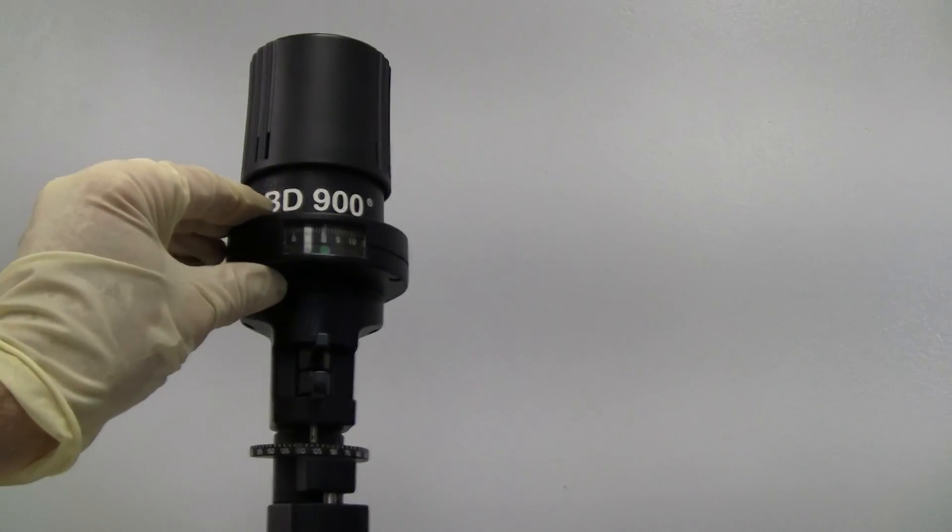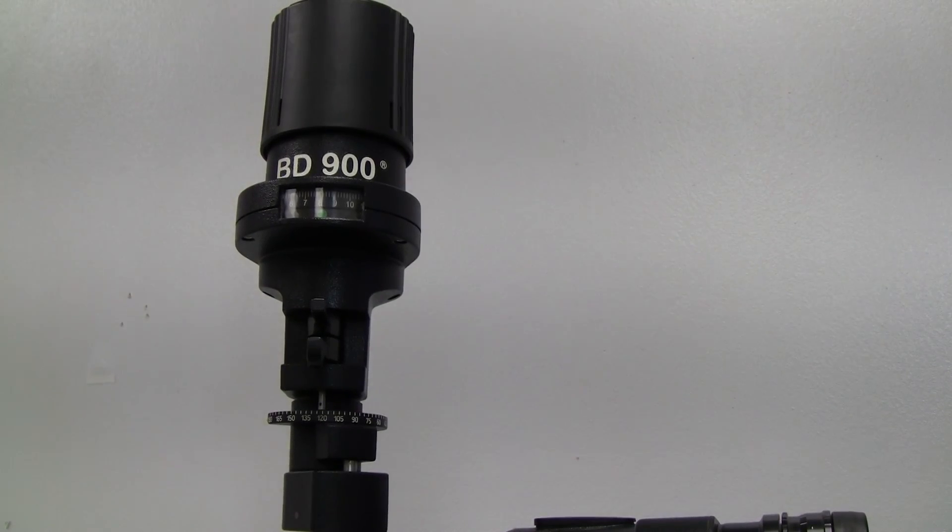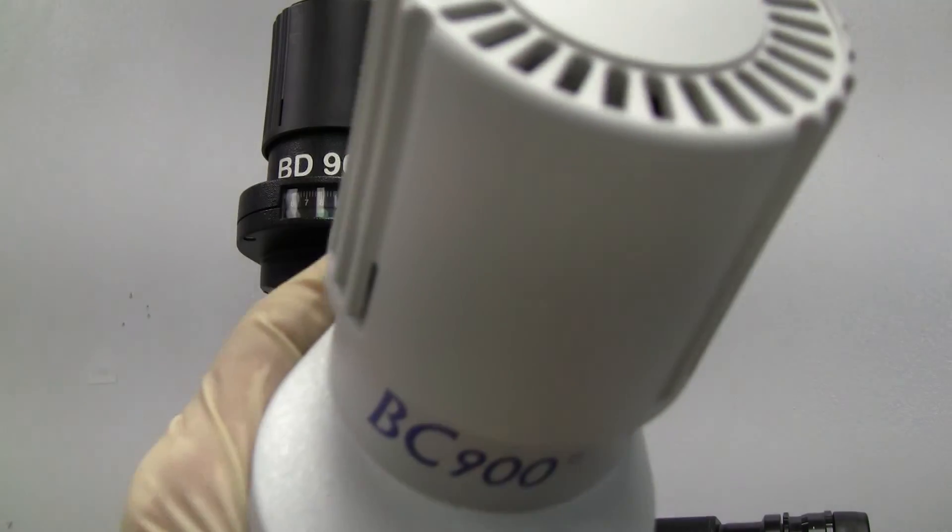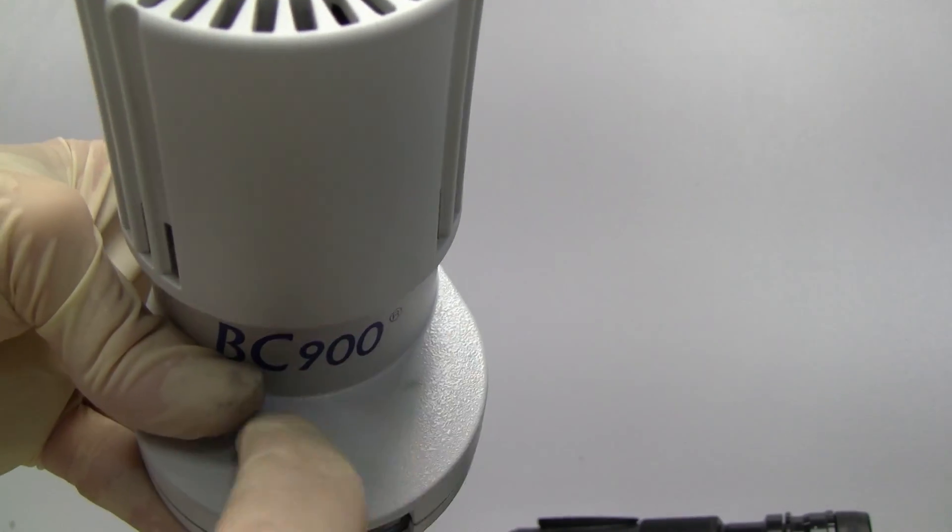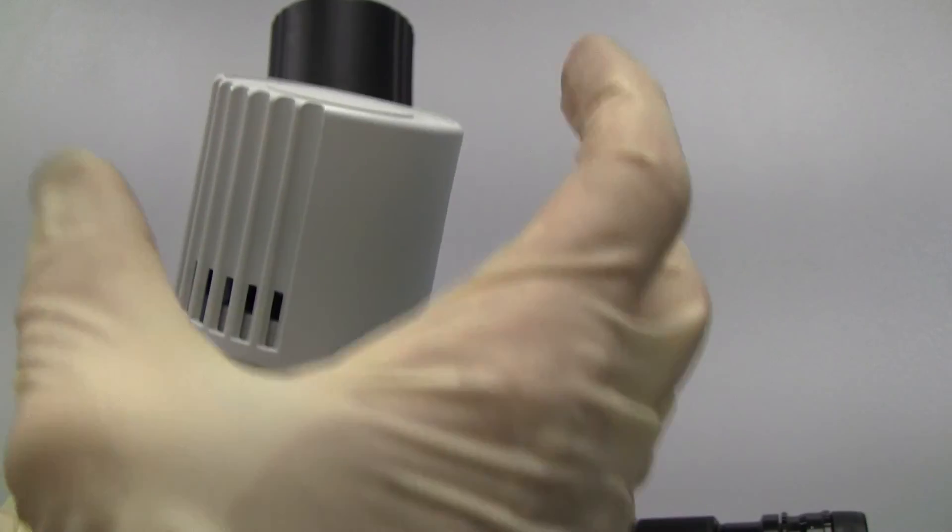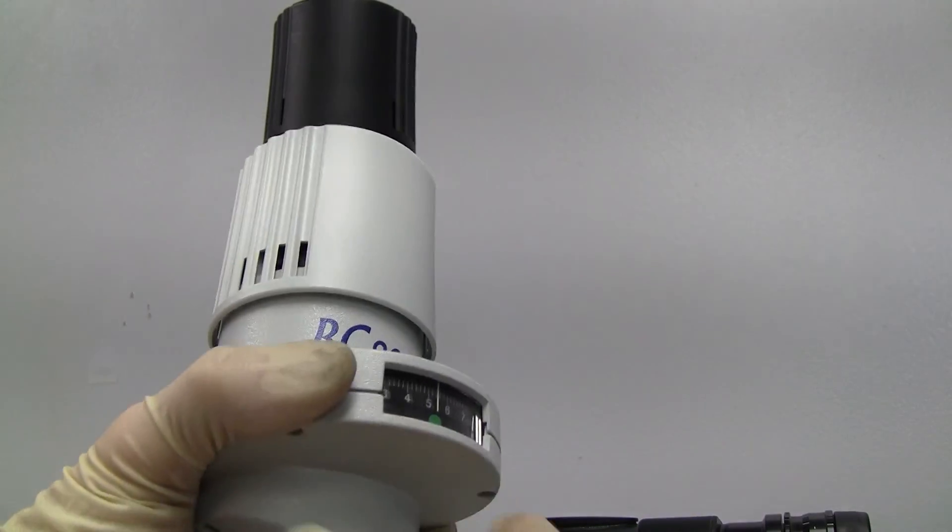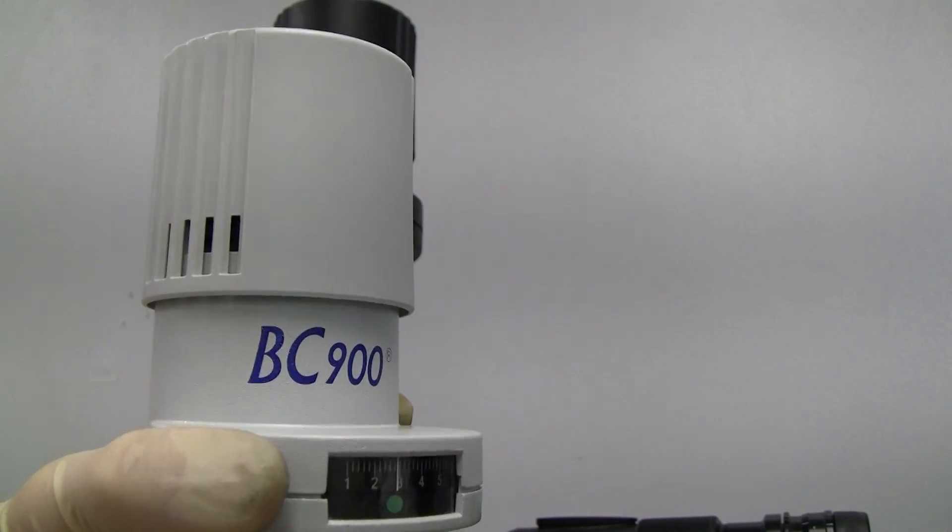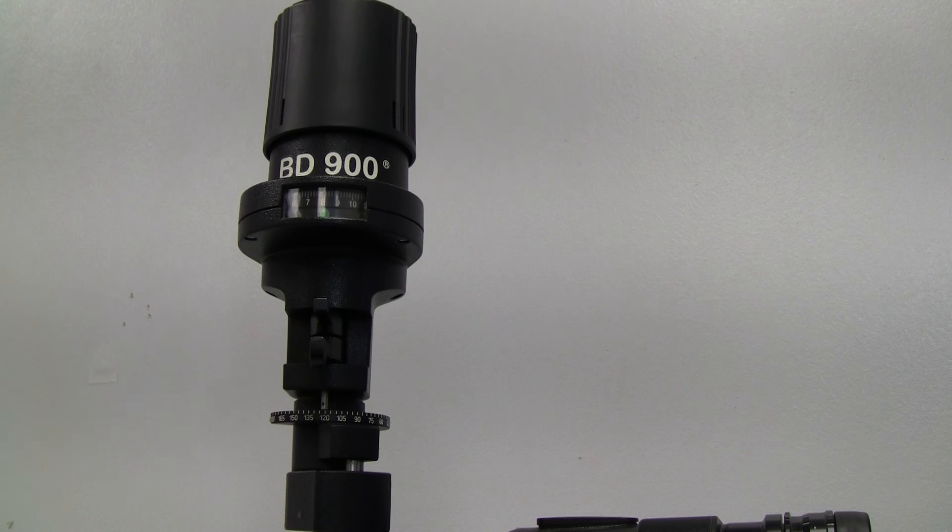So, on the BC and the BD, you cannot upgrade them to a LED because there are no screws up here for you to put your kit on top and screw it in. So, it's impossible to upgrade a BC and a BD to an LED.